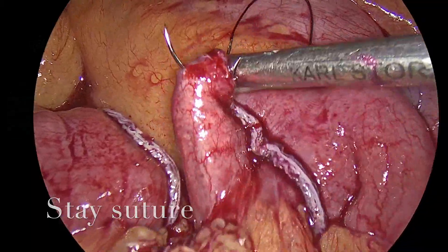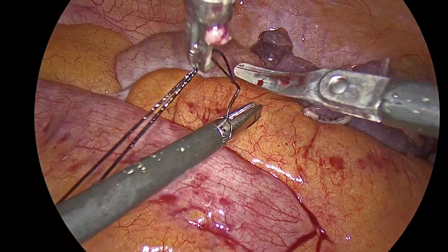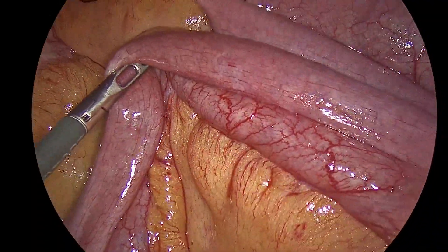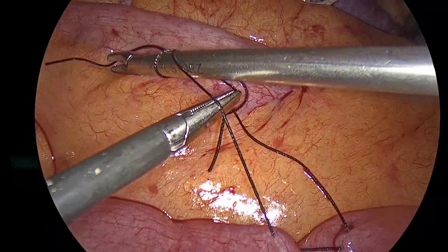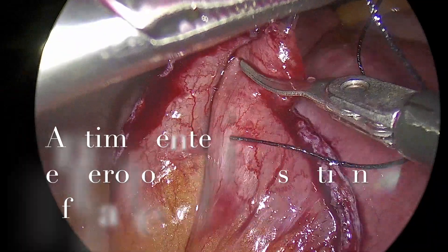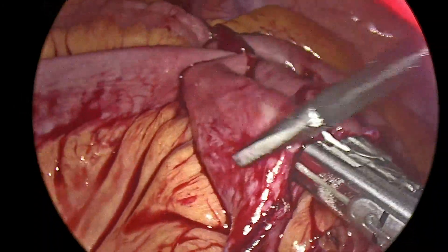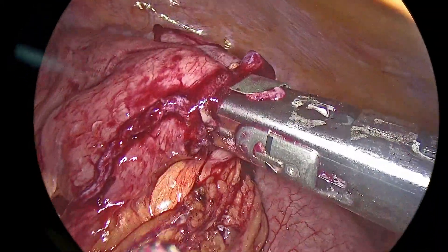First, we take a stay suture on the antimesenteric border of the divided end, then take another stay suture on the proximal part of both segments to align the two limbs of the resected bowel in a well-oriented manner. We then create an enterotomy and enlarge it on both limbs of the ileum so we can insert the linear cutter. After adequately lubricating with jelly and using traction and counter-traction with atraumatic forceps, we insert the linear cutter stapler.